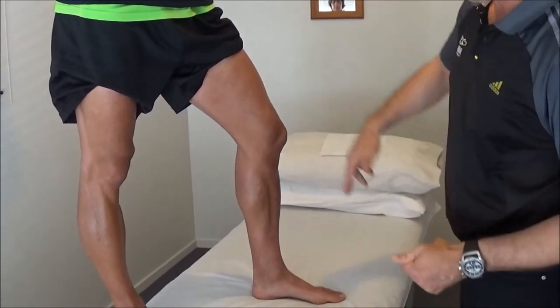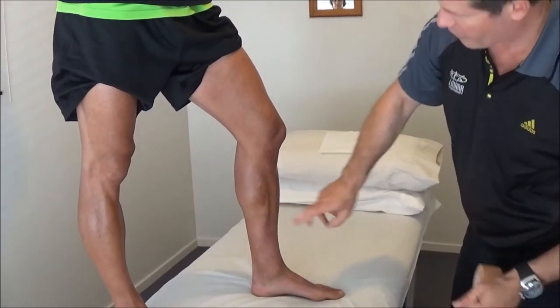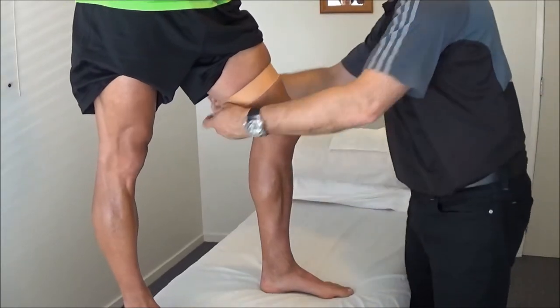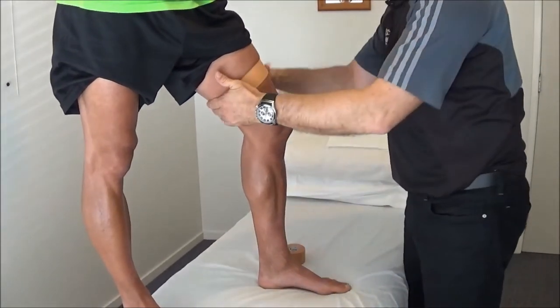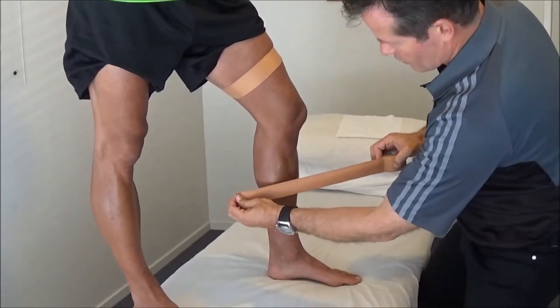Now what we'll do here, we'll come up about halfway up the thigh and just at the base of the calf muscle there, so I'm going to put a fixing strap on to start with. Not going fully around the whole circumference of the leg.